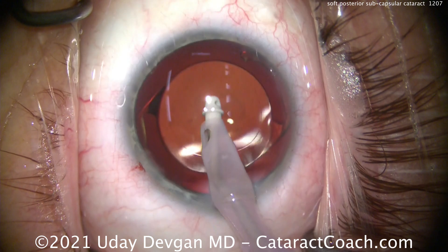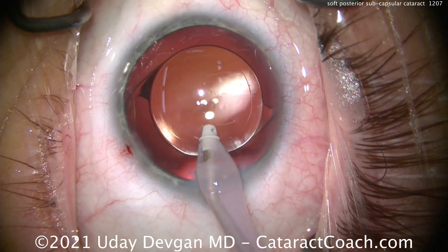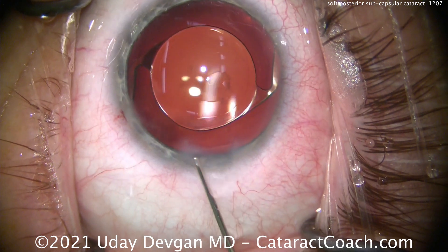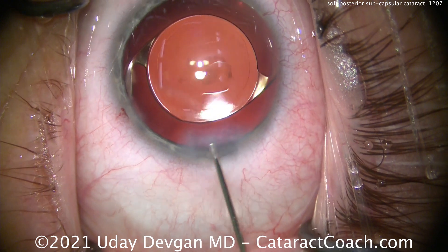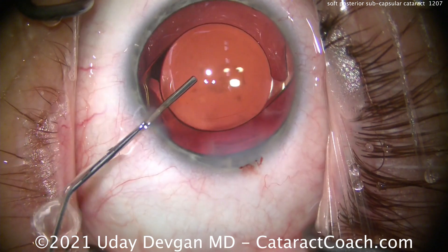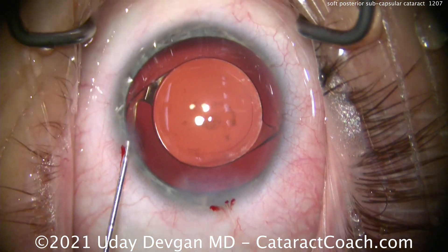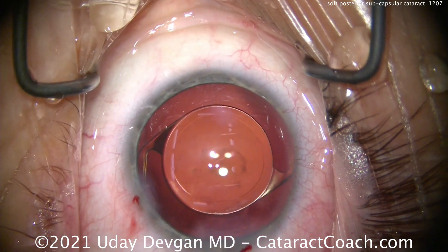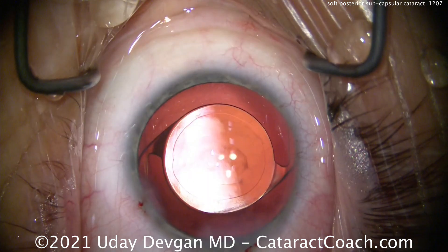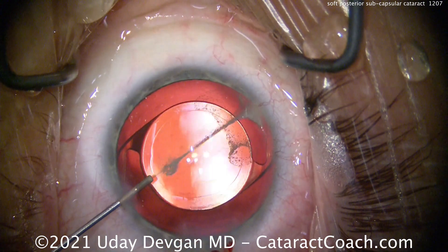Looking at the rhexis: the capsule overlaps the optic just beautifully — a 360-degree overlap with exactly a five-millimeter capsulorhexis. The signature of my surgery is the incision, the capsulorhexis, and lens centration — all three are excellent. Sealing the incision with minimal hydration; it seals very nicely. The tiny bit of haze on the posterior capsule is not a concern; we will see the patient back in six weeks for a YAG laser capsulotomy if needed. The Purkinje image is right in the center and the rhexis overlaps the optic beautifully.